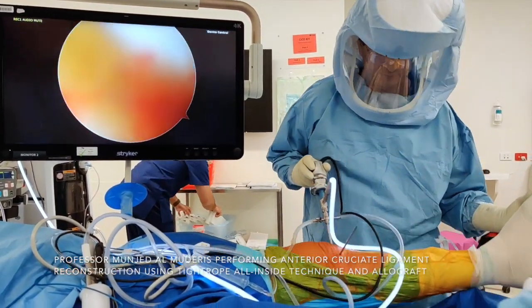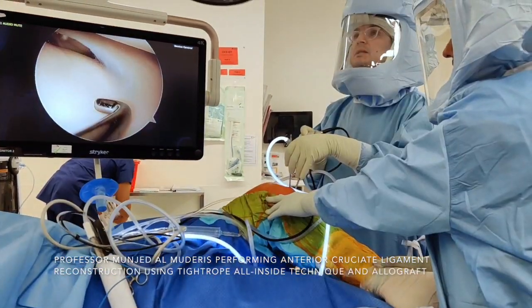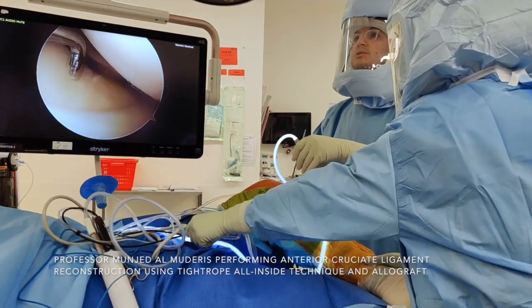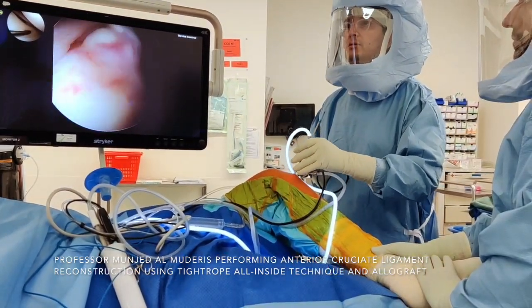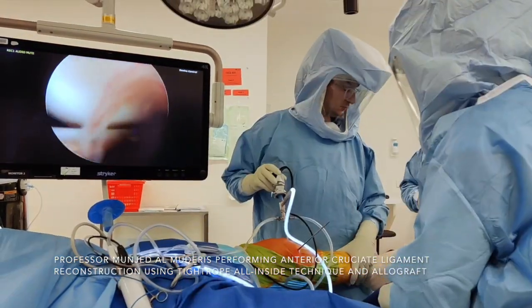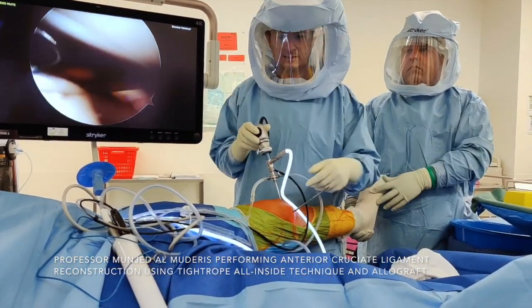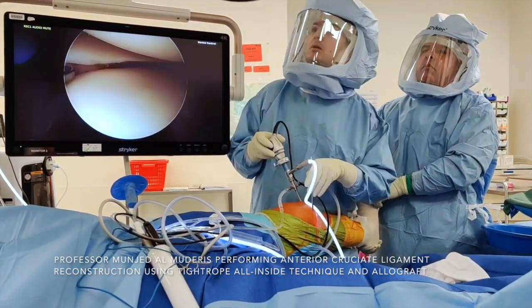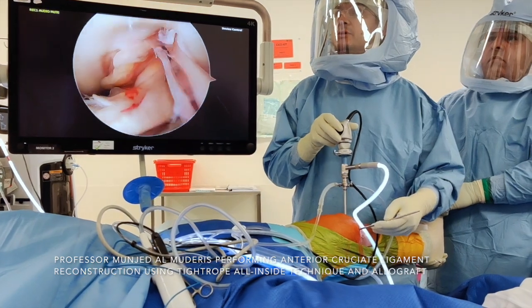This is an acute injury — you can see there is still blood at the ACL stump. I position the patient in a figure-of-four. We assess the lateral meniscus, and the surface is intact. I then look at the medial meniscus, putting the leg in valgus position in slight flexion and external rotation. The medial meniscus seems to be intact. We proceed to the ACL reconstruction.